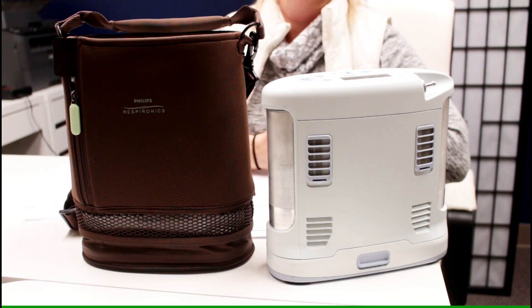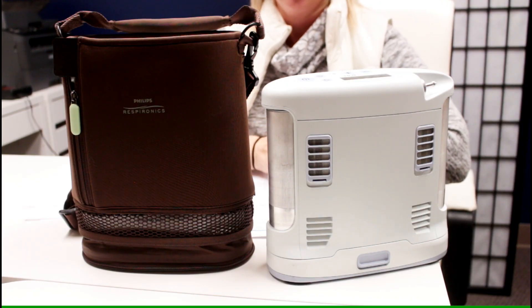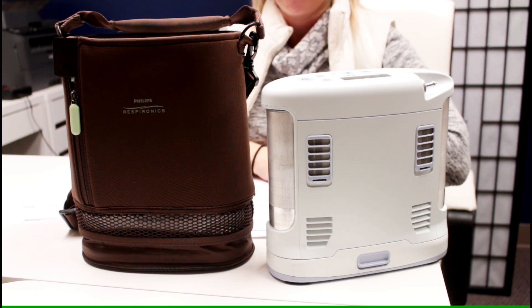For those who travel: has your oxygen concentrator been FAA approved? The answer to this question should always be yes. My suggestion would be to never purchase an oxygen concentrator that has not been FAA approved.